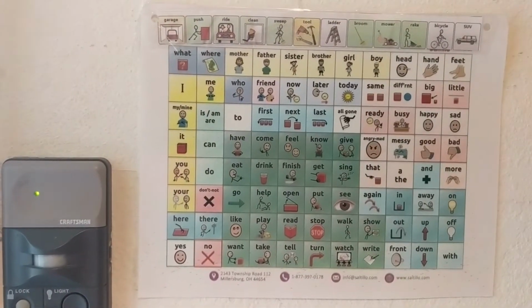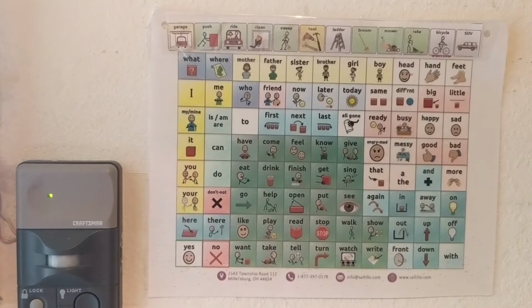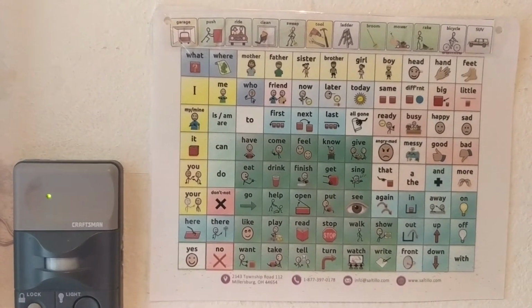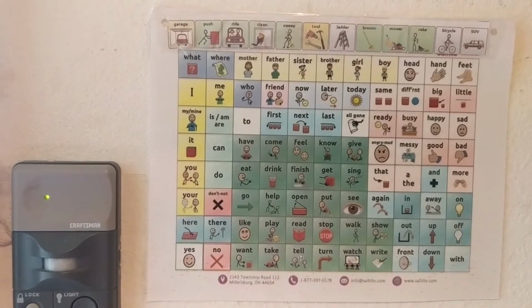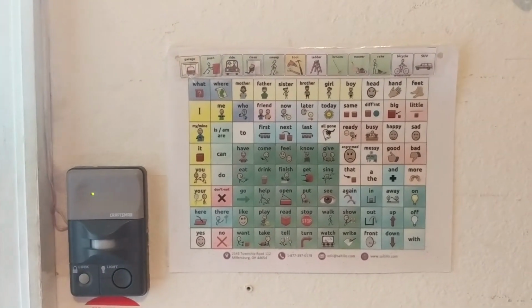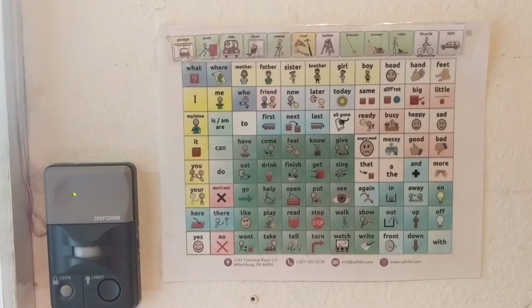And so those are just some words with the requesting, the getting assistance as well, different types of communication functions that you could communicate while you're in the garage. So those are just some ideas of how to have communication available and provide aided language input while you're at home using your AAC in the garage.